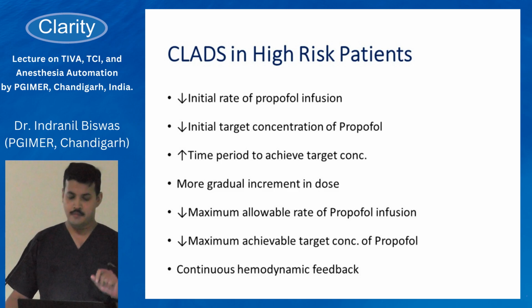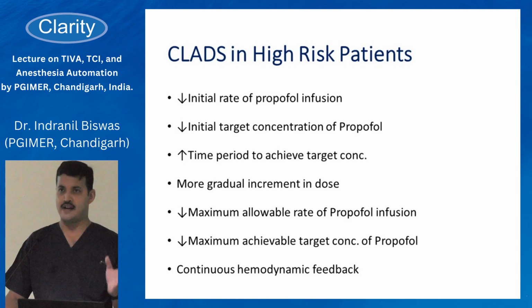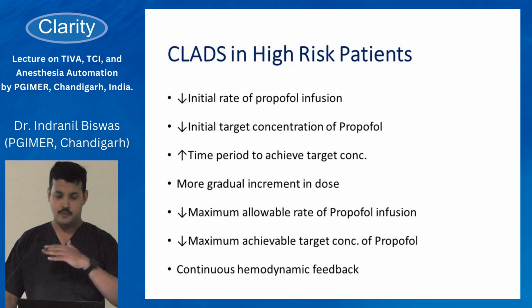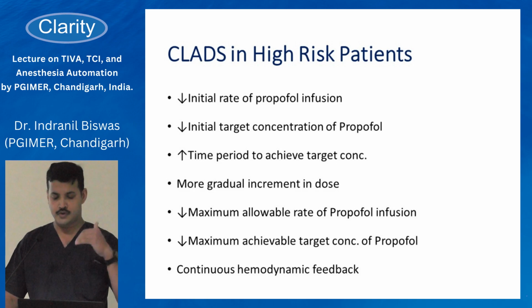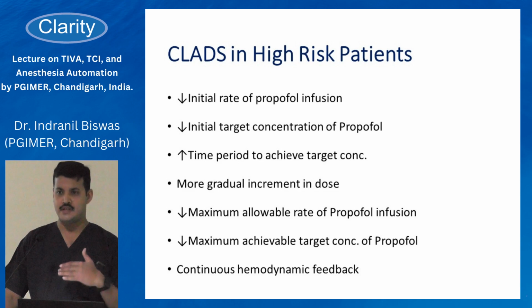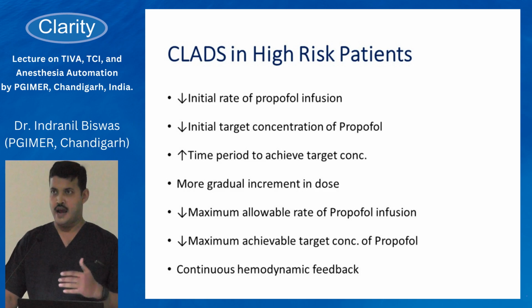At the same time, CLADS has continuous hemodynamic as well as BIS feedback from the vital signs monitor. Whenever the hemodynamics goes below a certain limit, which we can also choose ourselves, the propofol infusion stops by itself, and whenever the hemodynamic parameters are again within normal range, it automatically starts infusing the drug again. The delay time is really small, and the response time is only 10 seconds in this case.